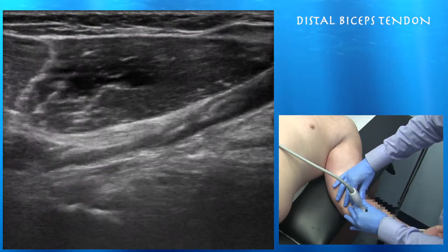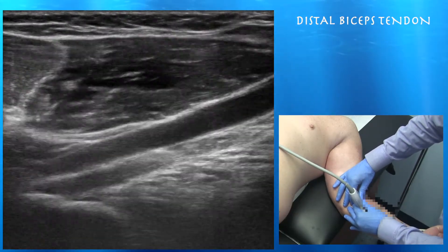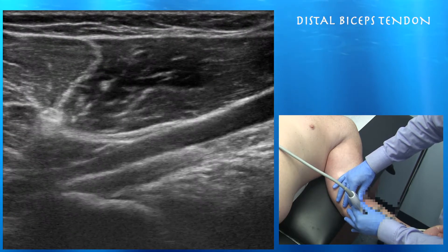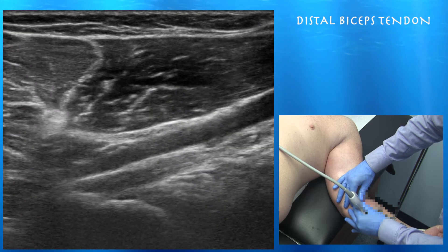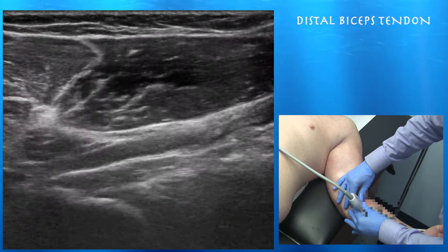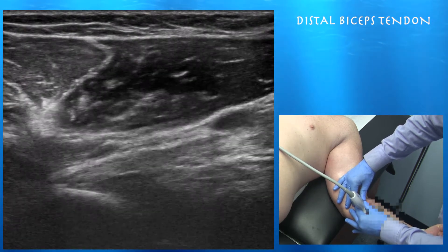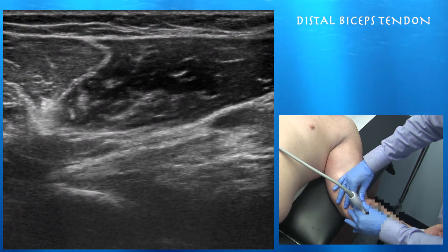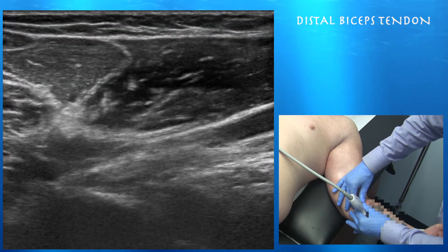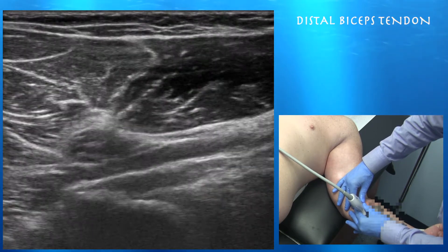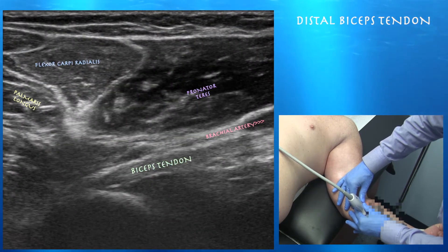Here we're doing a medial approach with the elbow bent to about 30 degrees. You can see the brachial artery, and underneath that is your biceps tendon inserting on the radial tuberosity. You really have to heel-toe your ultrasound probe when you do these maneuvers in order to get that view of the biceps tendon inserting on the radial tuberosity.